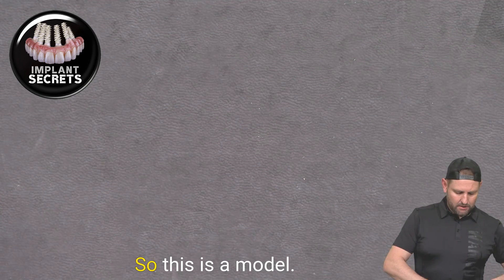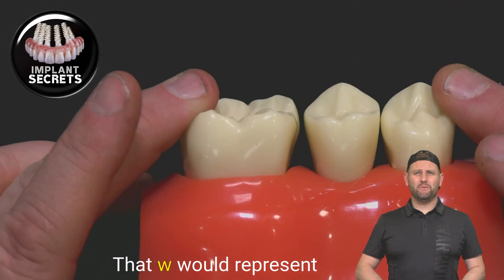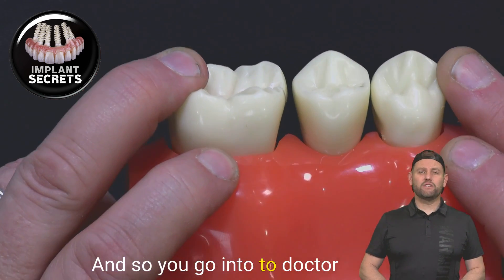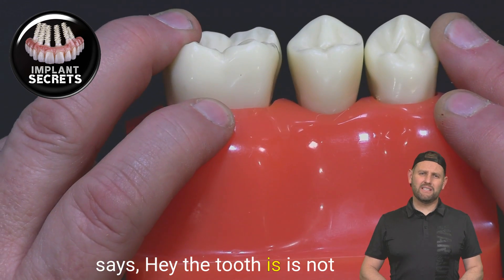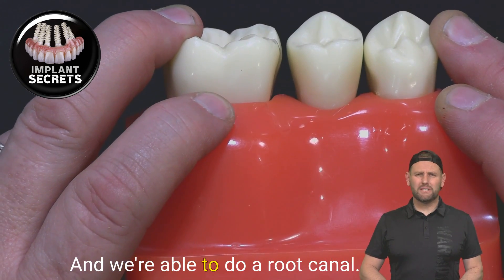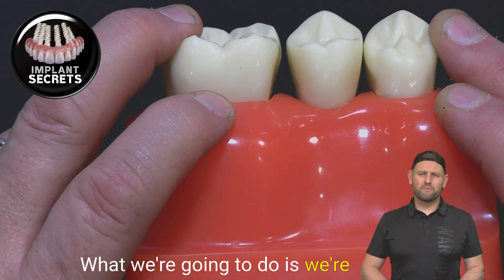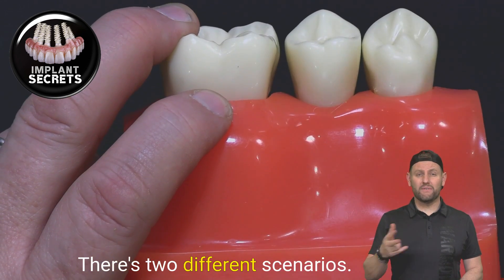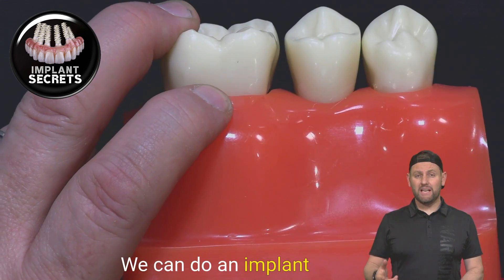Let me show this to you. This is a model that would represent someone's three teeth in their mouth. So you go to the tooth doctor and they say the tooth is not able to be saved, and we're not able to do a root canal. So what we're going to do is take a tooth out and put an implant in. There are two different scenarios: we can do an implant or we can do a bridge.